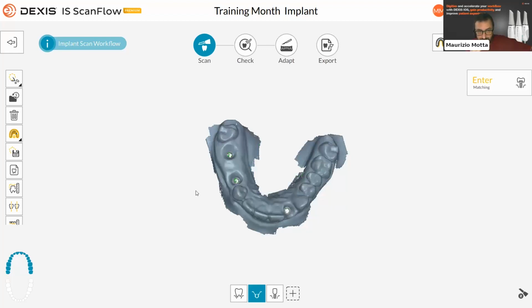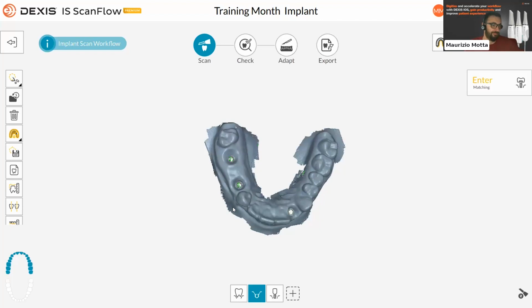Otherwise, simply doing multiple scan bodies one by one also guarantees the highest level of precision in terms of preventing the soft tissue from collapsing in on itself. But if you take too long between scan body scans or preparing the scanner to scan the rest, so do things one by one, step by step, and keep general best practice scanning technique in mind, and you should be fine. Avoid scanning the scan body from the head. That's the best suggestion I can give you.